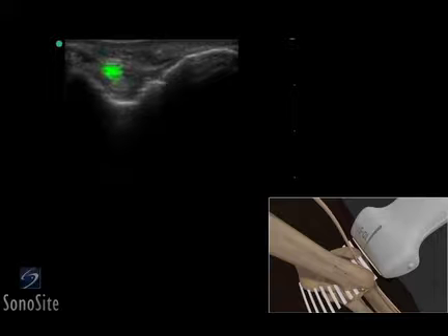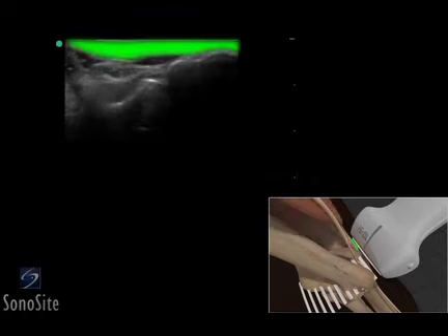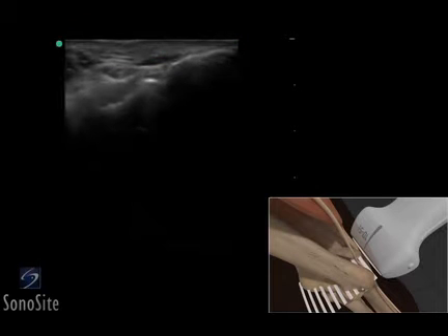The ulnar nerve can be seen as a hypoechoic, fasciculated structure near the medial epicondyle. The triceps tendon appears as a hyperechoic area overlying the olecranon process.